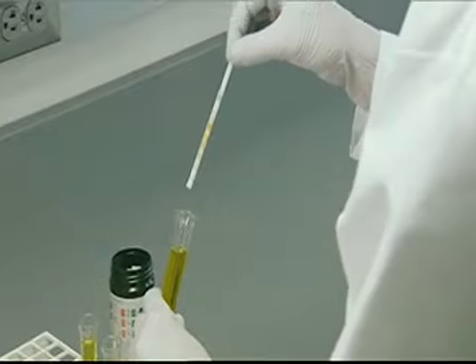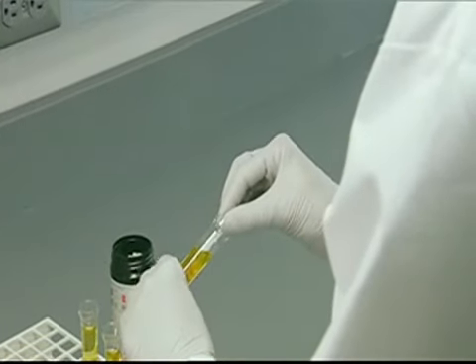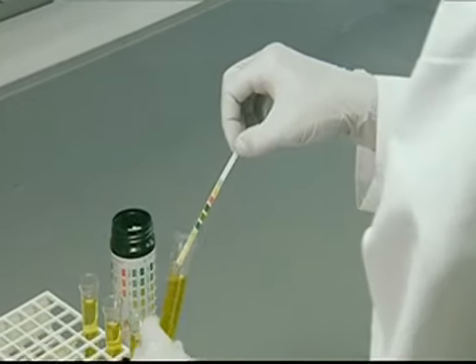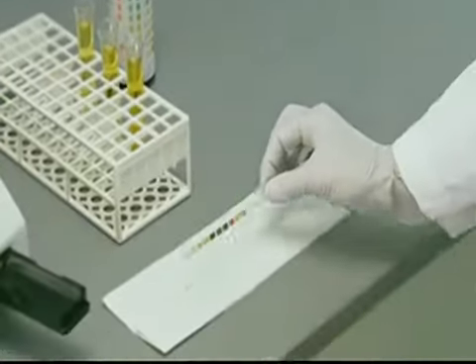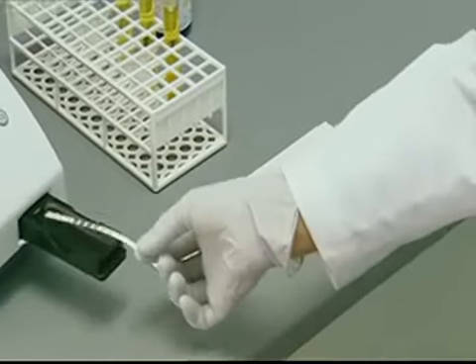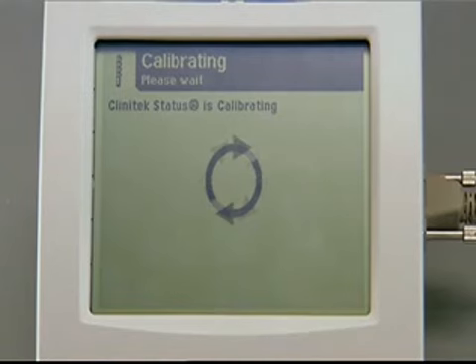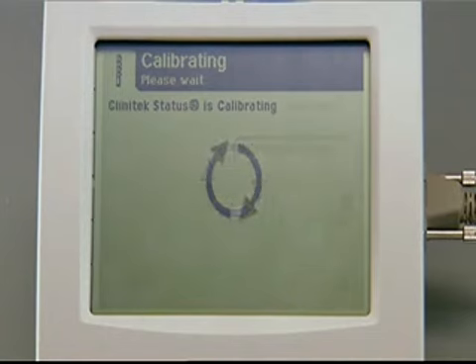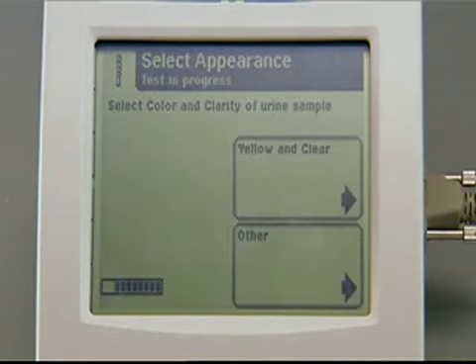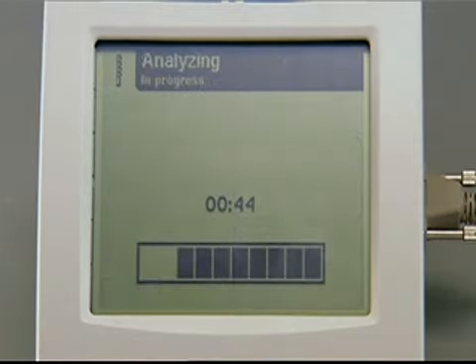Tip the reagent strip into the sample, drag the edge against the side of the container, blot the strip, and place it into the test table. While the instrument is calibrating, the Select Appearance screen displays a request for information on the color of the sample. In this example, we'll select yellow and clear.